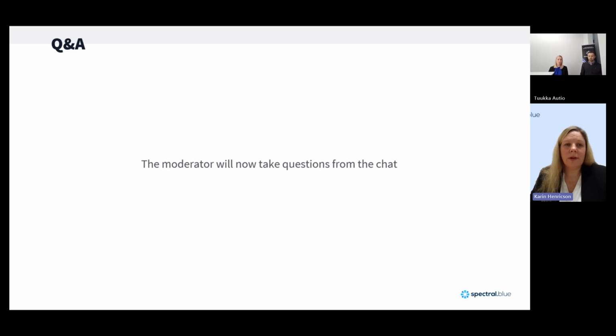In the mail that we got before the webinar, there was also a question about resistance, and the question is, are there any bacteria, virus, or spores that are resistant to blue light? Answer is no. To this day, there is no sign of any resistance towards blue light, and it's also considered quite difficult for the microbes to develop resistance towards blue light. But having said that, no one can state for sure that that is never ever going to happen. But right now, there are no resistant microbes, and this technology works really well on the strains that are resistant to antibiotics or biocides or UV light.